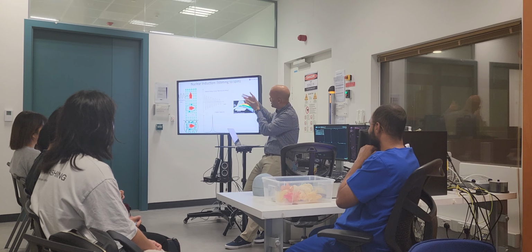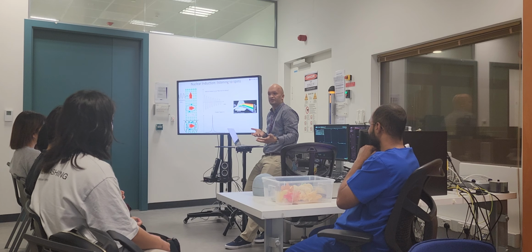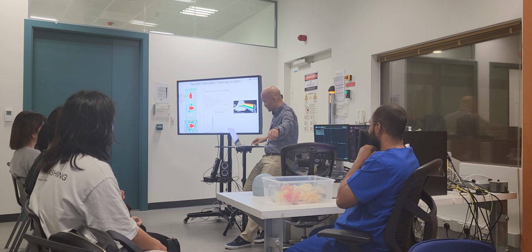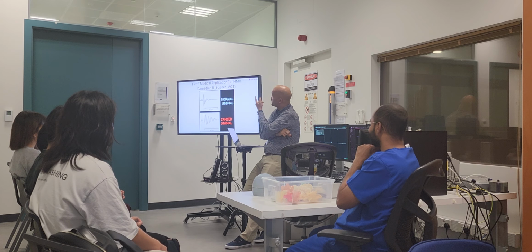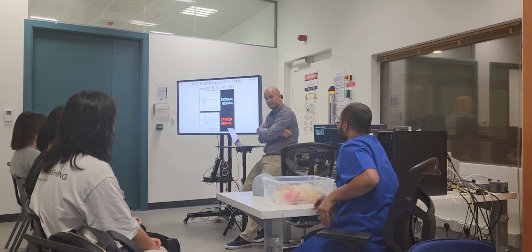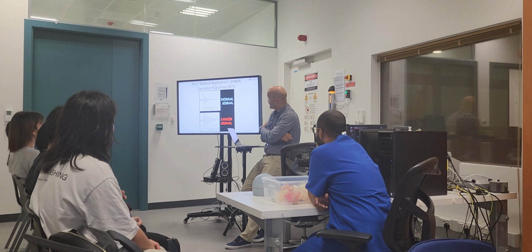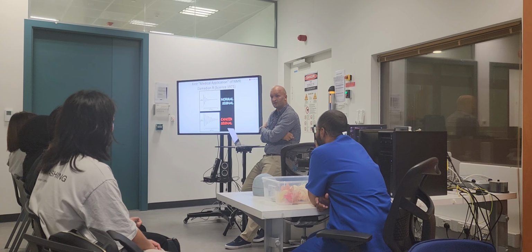But if you say, I put my water bottle inside the magnet, I give it energy, it relaxed, and I generate it, and I get this, so who cares? Okay? Other than that, chemistry people. Until somebody came in the 1970s, like, oh, if you put a tumor tissue in an NMR machine, then you have different relaxation, different FID than the normal tissue.